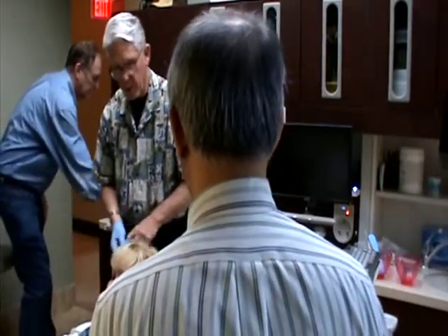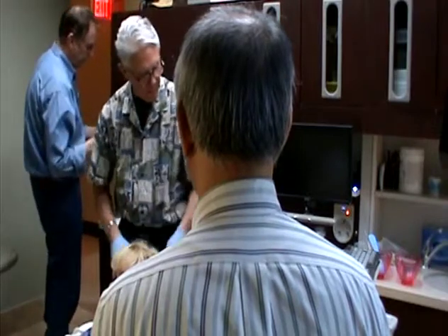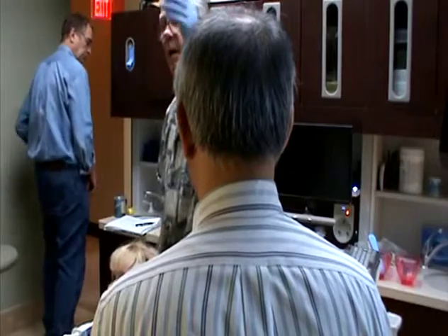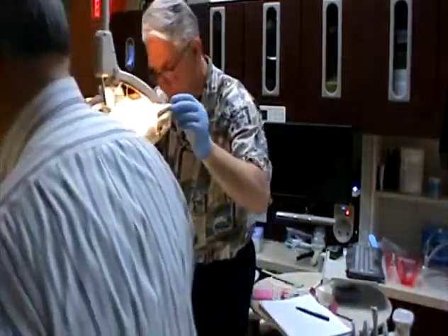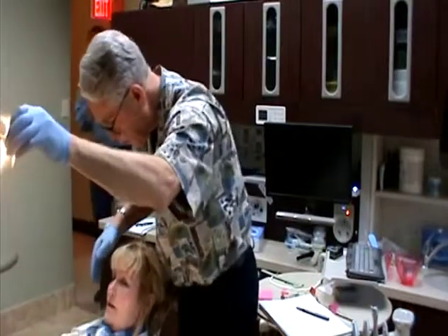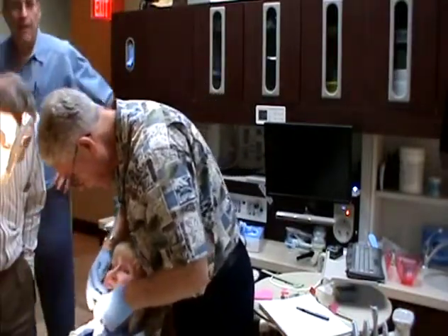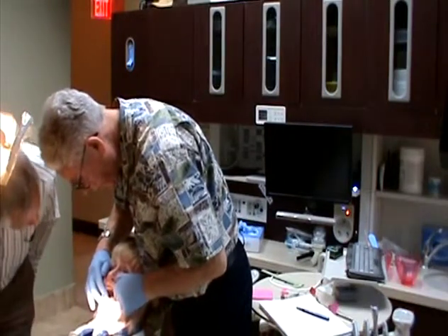Yeah, the second molars always get depressed when you do that. These are on the bicuspid, so you're pulling up the molars? You've got them on the bicuspid to pull up the molars, is that what you're doing? Yeah, that works on people. Oh, you don't have a second molar, that's why. You better do it that way.